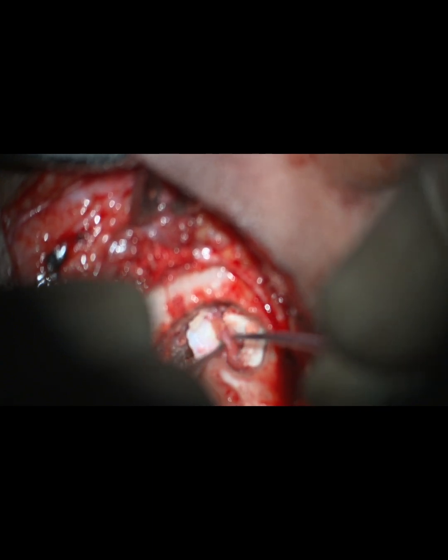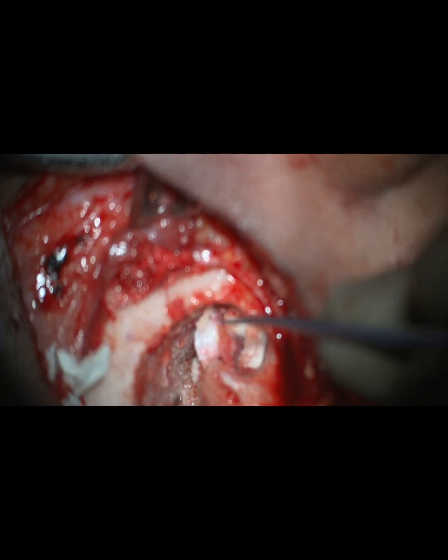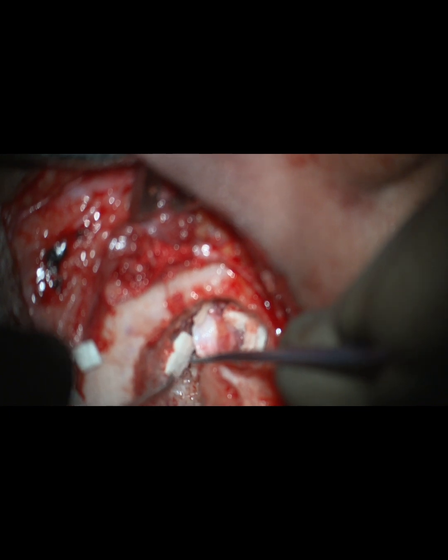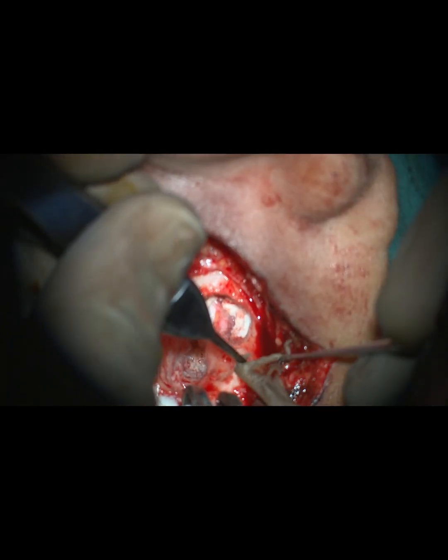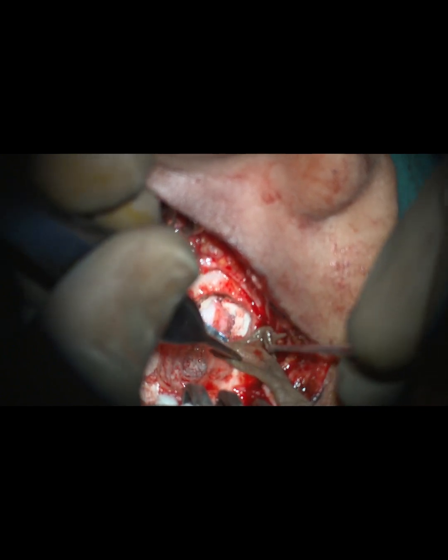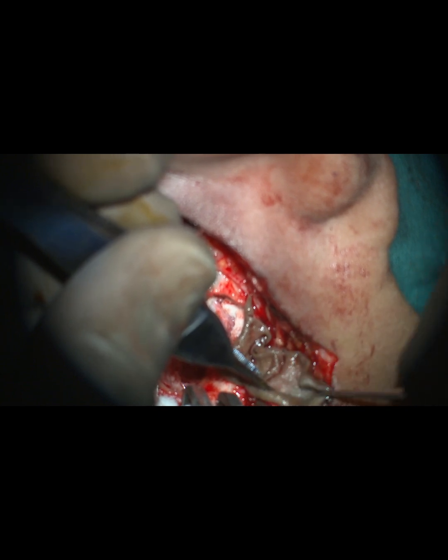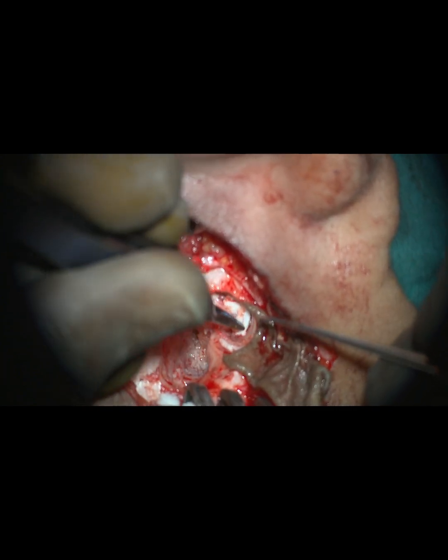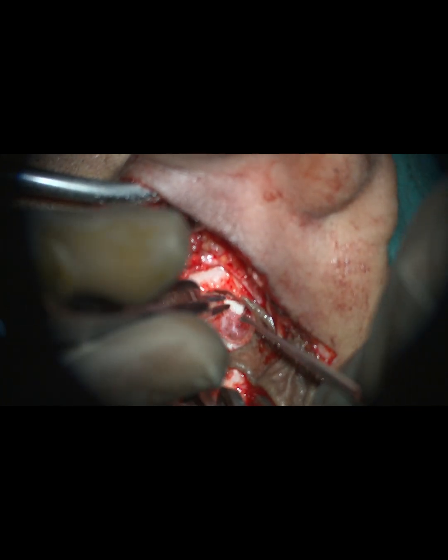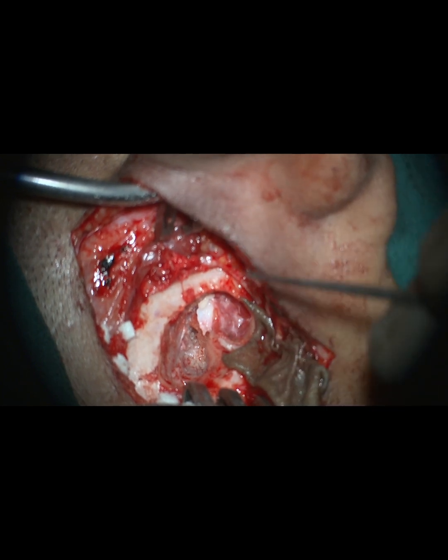Again, gel foam pack was placed within the mastoid so as to avoid displacement of this cartilage in the immediate post-op. This was the skin graft. It is important to measure the length and breadth beforehand. The gel foams are removed so as to keep the graft directly over the temporalis fascia all around over the bony canal.